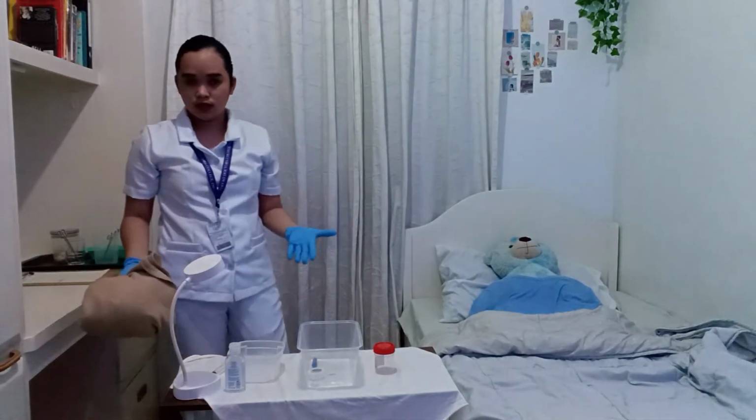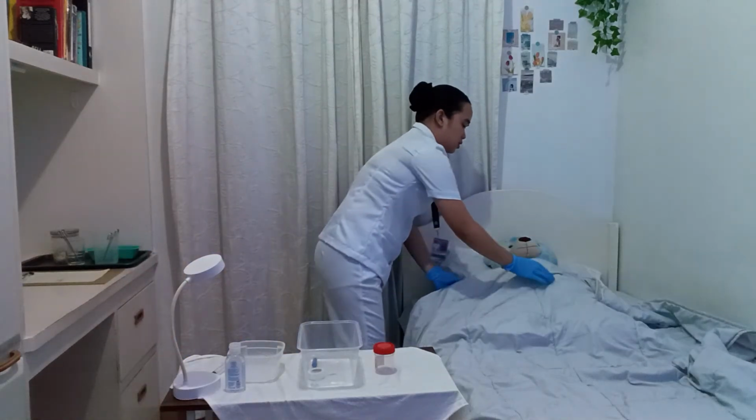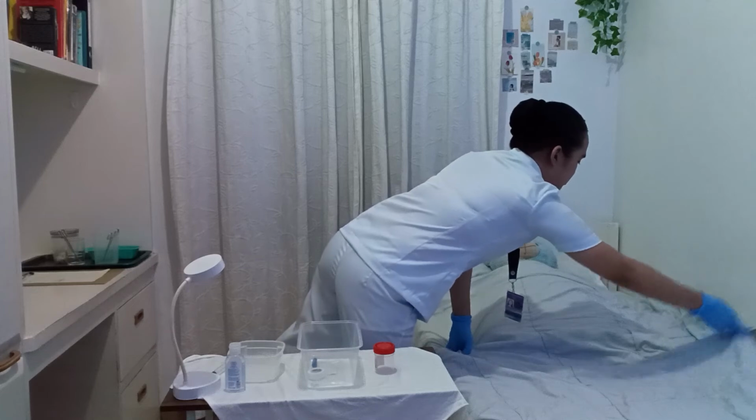So I'm going to place this in the medical hamper. And I'm going to drape you with your blanket, ma'am. So, ma'am, how was your feeling? Alright. So, that's good to hear, ma'am.